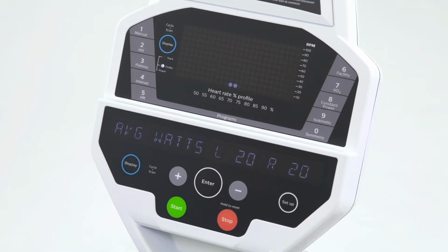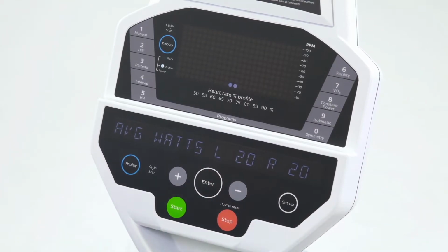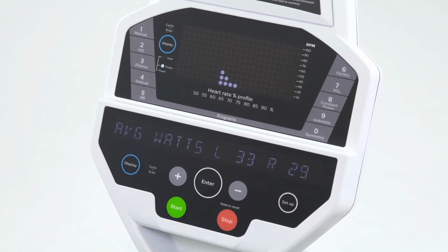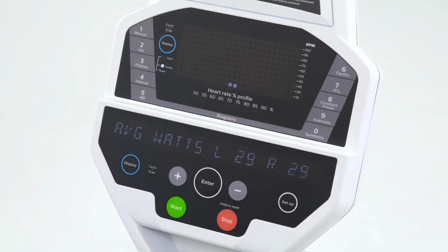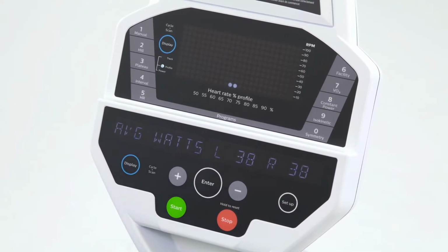So now as I'm pedaling and I'm symmetrical, so I'm getting watts of left and right 20. So if I increase watts on one side, I'll be able to see that asymmetrical watt measurement, which is not easy to do when you're symmetrical. I am trying to do it, but basically what I would see is my left and right watts here, and I would get a graphical feedback that shows me which side is more powerful on the right or the left.